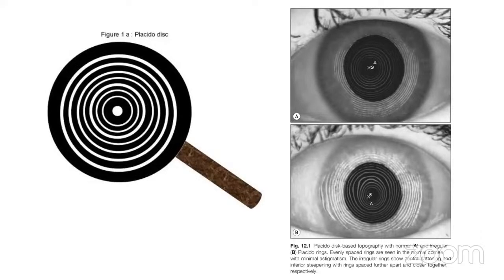This is the Placido disc instrument, which has alternate white bands and dark bands. The distance between the rings, the distance between the mires, is noted. If the distance is too crowded, it is considered a steeper part, while if the distance is far away, it is taken as a flatter cornea.